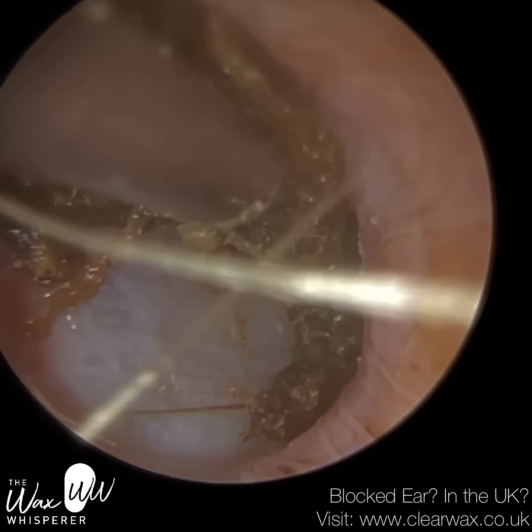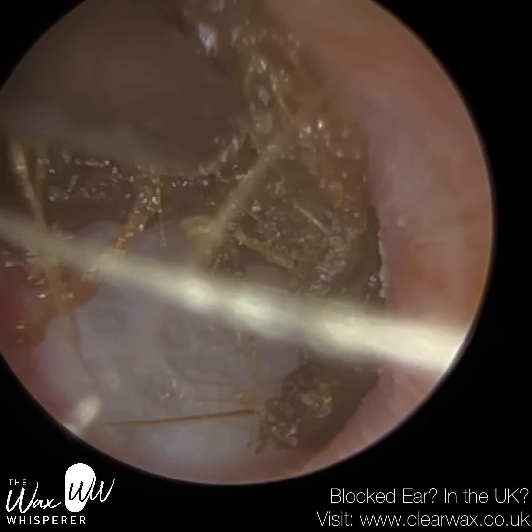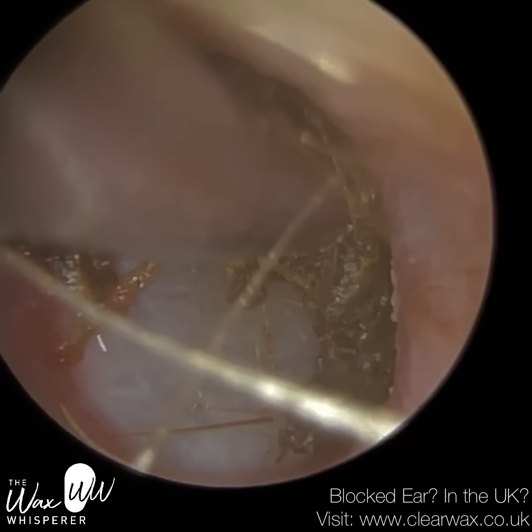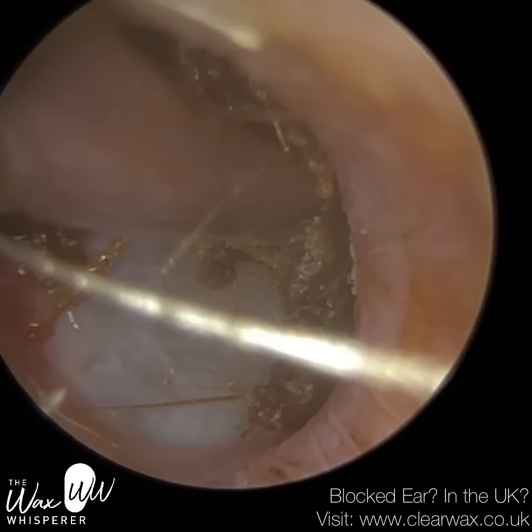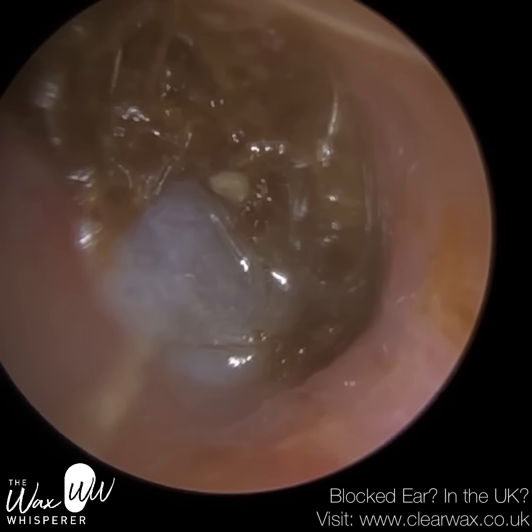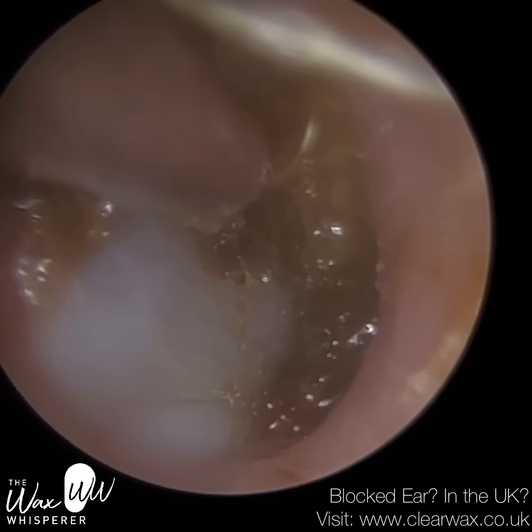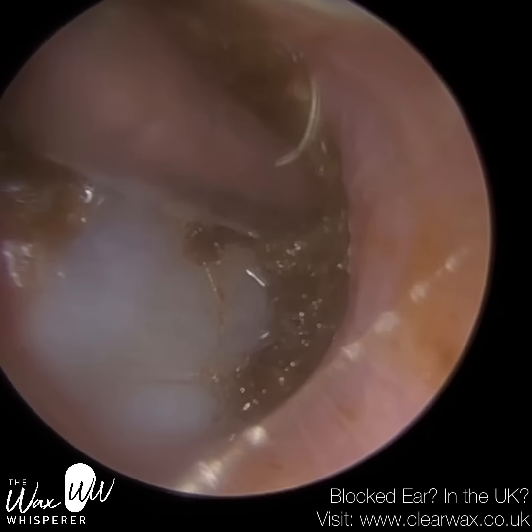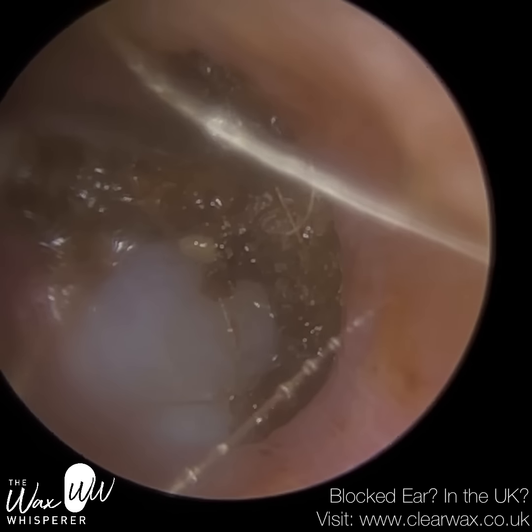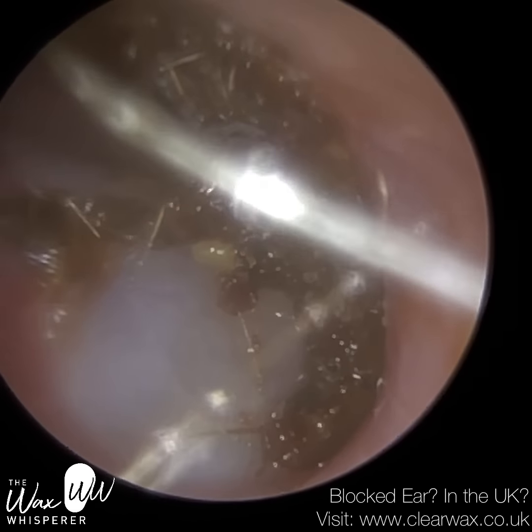However, we've now got more hardened wax lodged right up against the eardrum in a region called the anterior recess and also the inferior recess. As the ear canal travels towards the eardrum, there's a narrowing about half a centimetre in front of the eardrum — we call that the isthmus, which is just a generic term for a narrowing. Beyond the isthmus the canal widens back out, creating a recess like an alcove at the front part near the eardrum — the anterior recess, meaning to the front. It can also create a narrowing and widening at the inferior recess, almost like a trench or basin at the base of the ear canal near the eardrum.